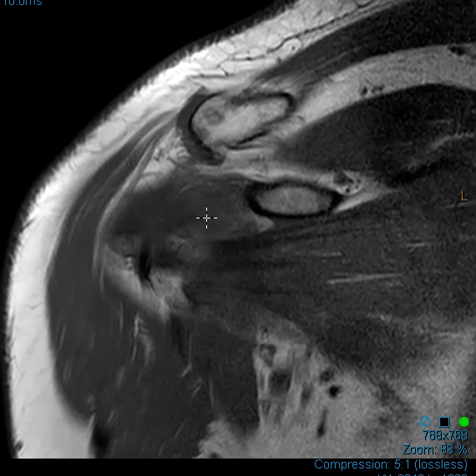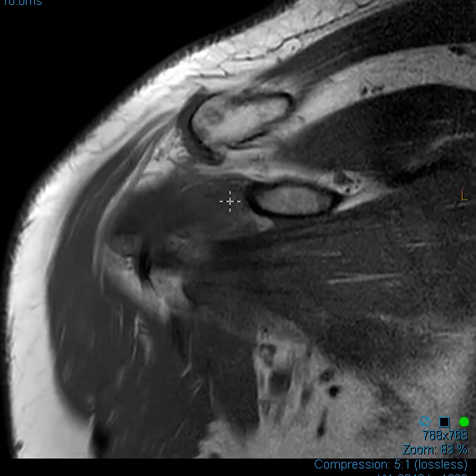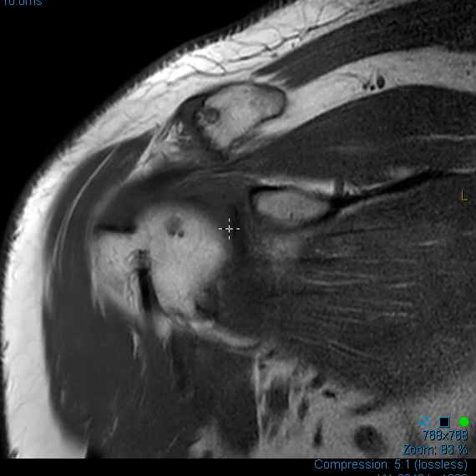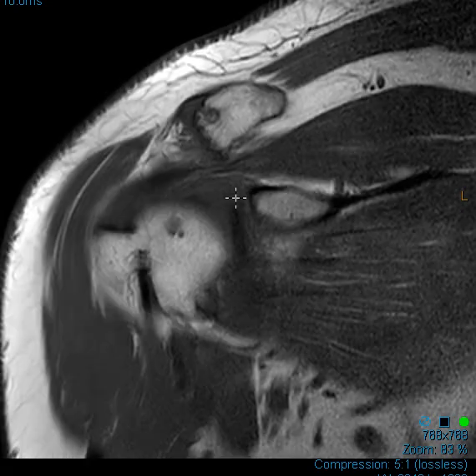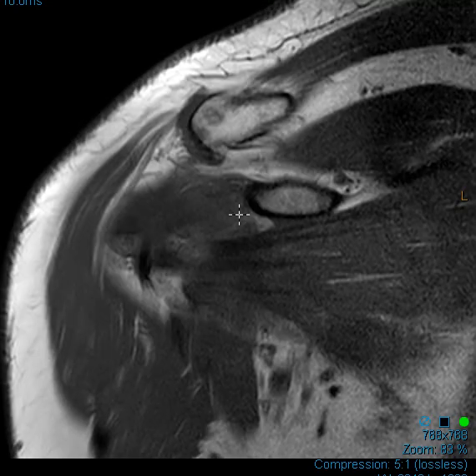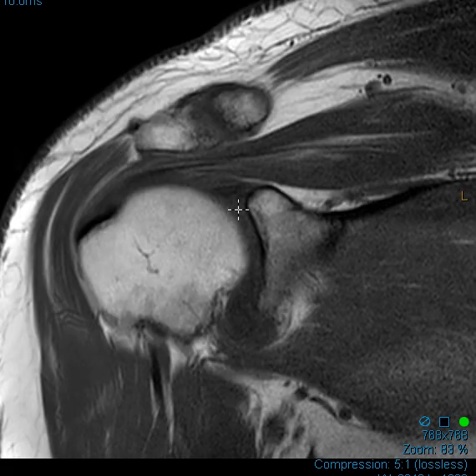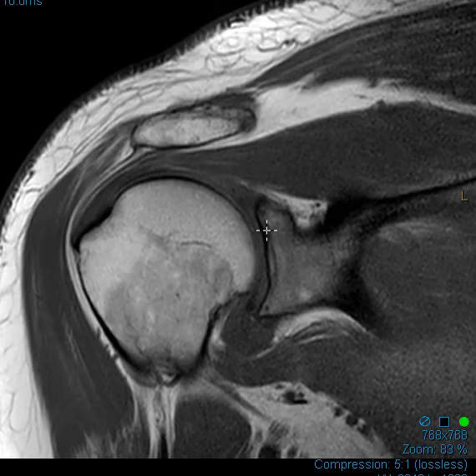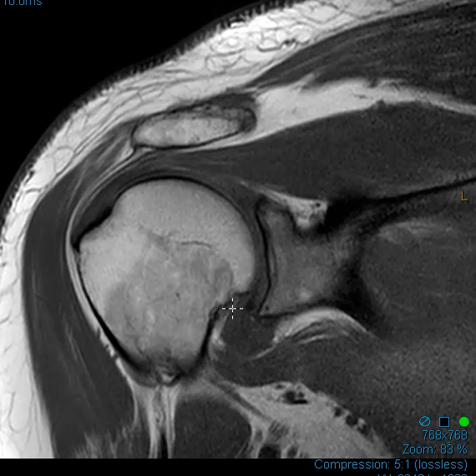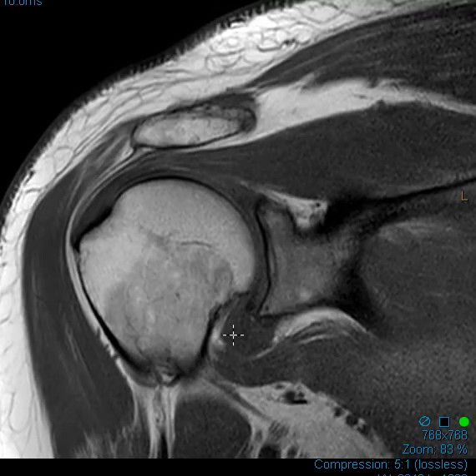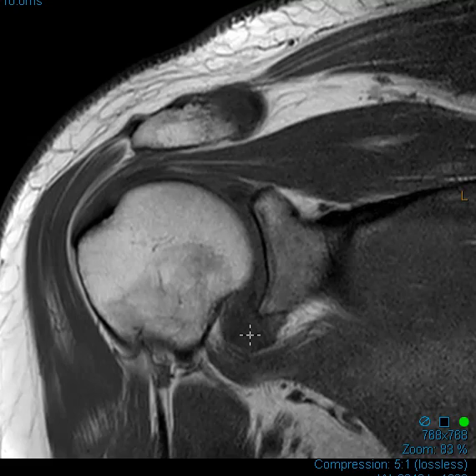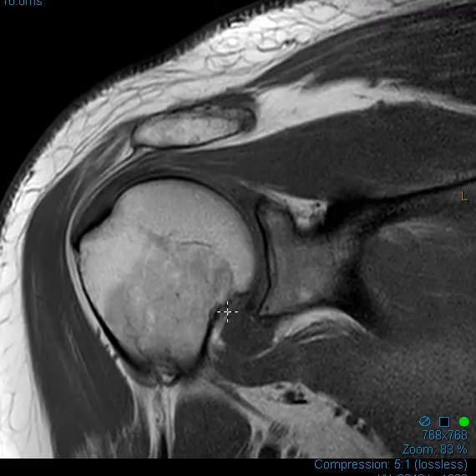Normally, this will have fluid or maybe fat — this is subcutaneous fat. You should see a little triangle of fat in here, but instead we see a big mound of just intermediate signal, which is that inflammatory response — prominent inflammation or scarring. Also, the inferior joint capsule can look thick. Normally it won't be nearly as thick, but it looks like a big thickened inferior joint capsule — capsulitis.